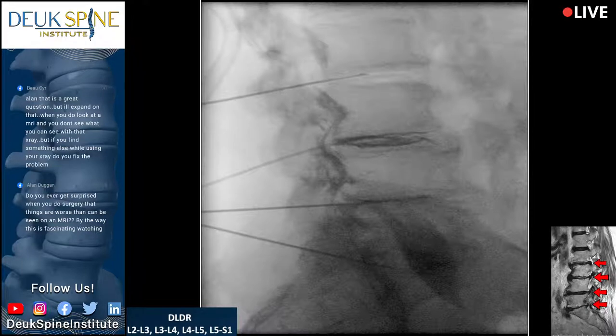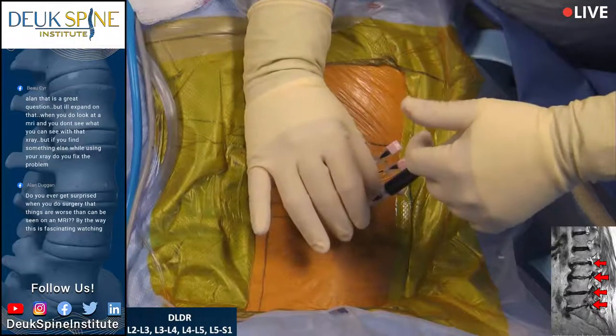All right. You're doing great. We're almost done. So his tears are so big that the dye is just all leaking out. I'm not even able to pressurize the disc at all. So let's see what happens here.